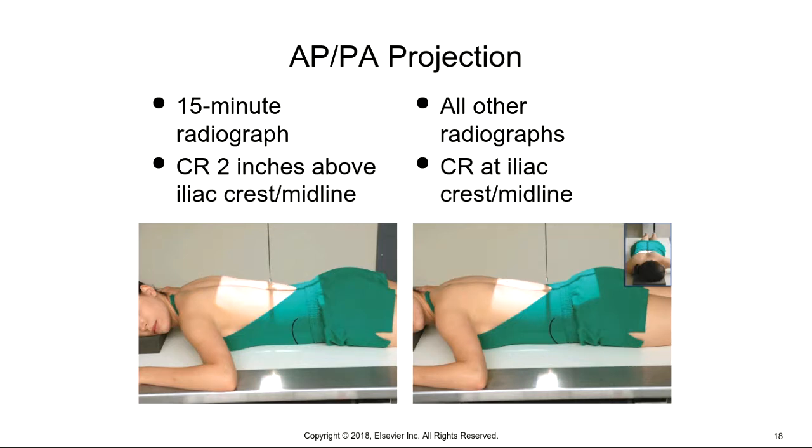Now, something I did not mention yet, which I should have, is these images are timed. Anytime you have a study that is timed, it is considered a functional study. Functional study, meaning you're looking not so much at anatomy, but at the function of that anatomy, meaning you're trying to see how long it takes for food to go through the small intestine. All right, I'm trying to find where you could actually read that. Hang on one second.